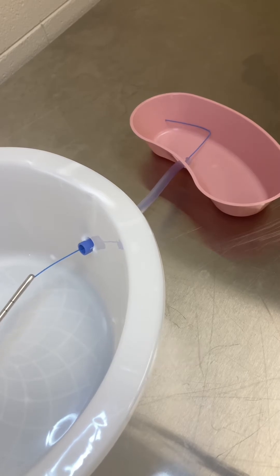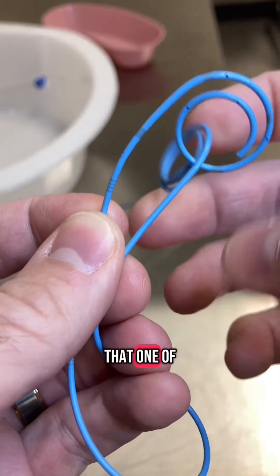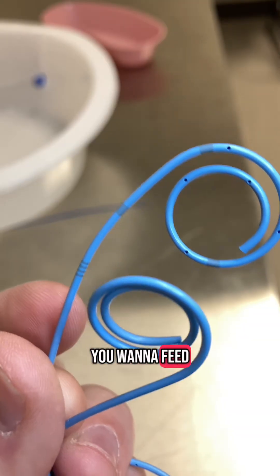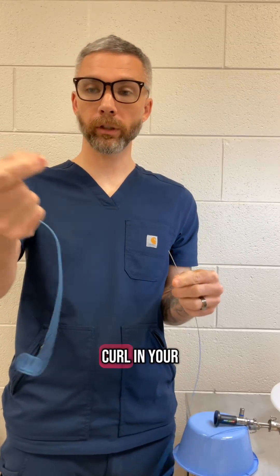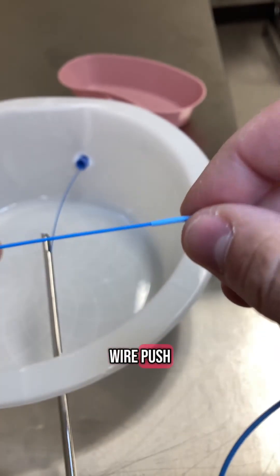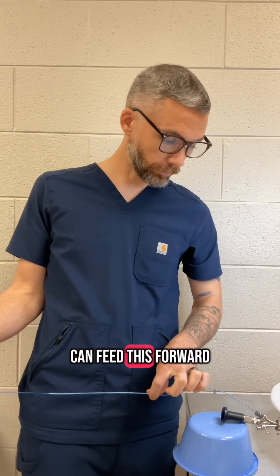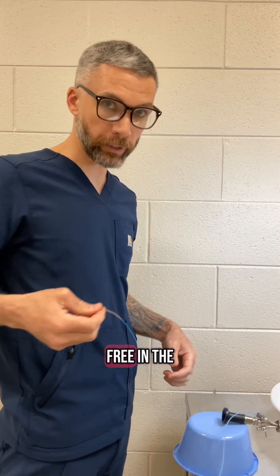It will run into the kidney. If you're putting a stent up, the stent has two ends. You can see that one of them has little lines on it — that gives a measurement. You want to feed the end that has no lines onto the wire first. Hold the curl in your fingers onto the wire, hold this one still, and let it feed. As a surgical tech, as soon as you've found that wire, you can hold it back straight so they can feed the stent forward.